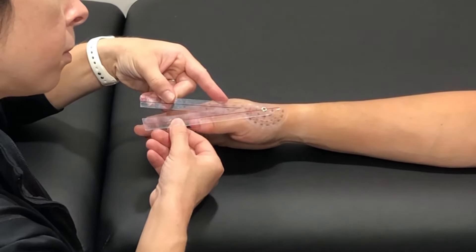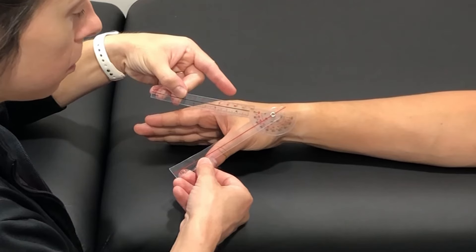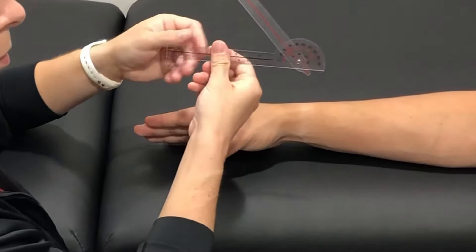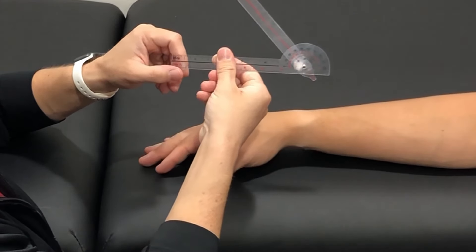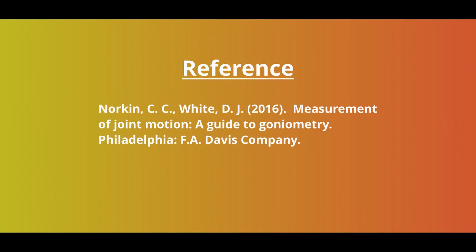Go ahead and abduct. And that is abduction of the carpometacarpal joint of the thumb.